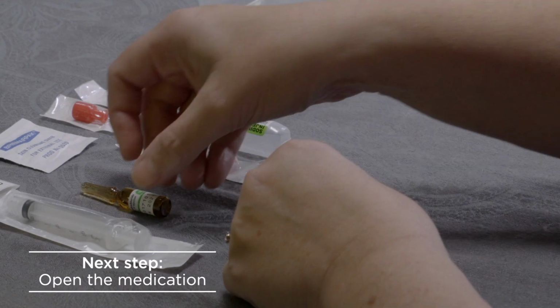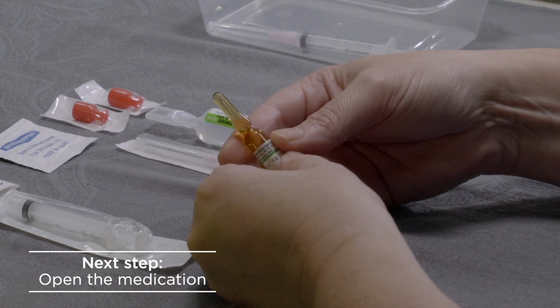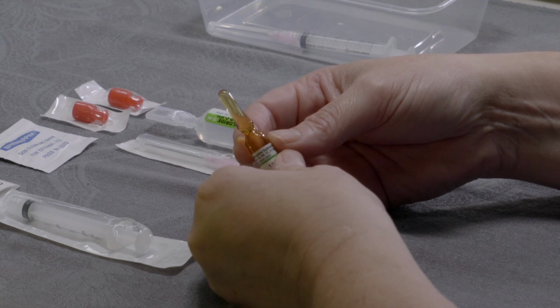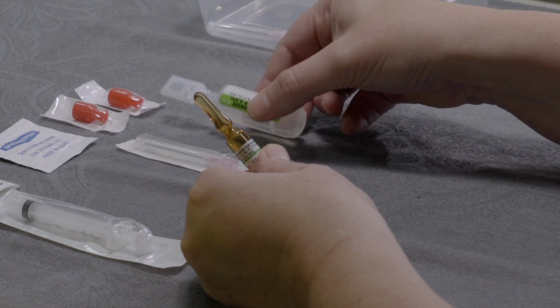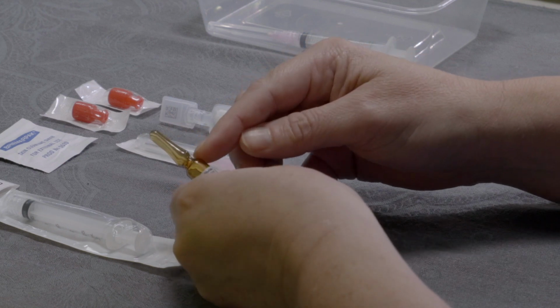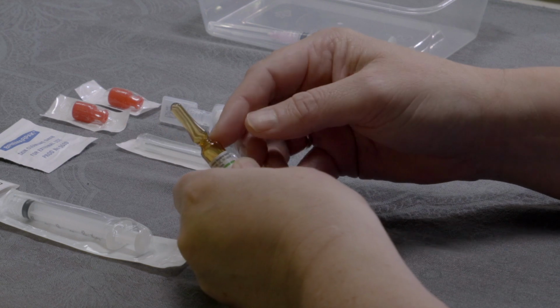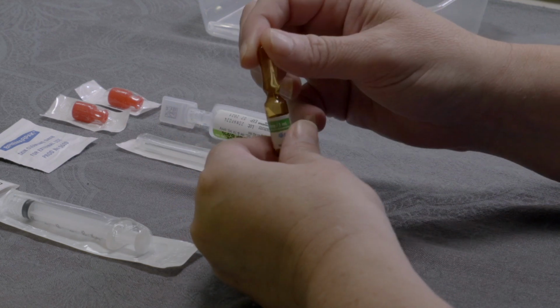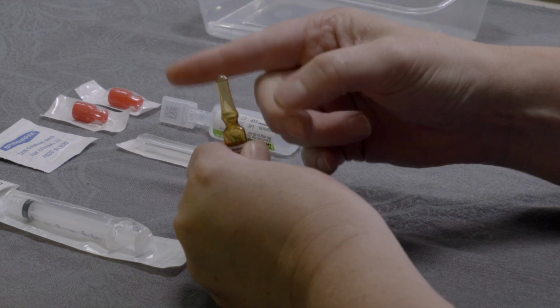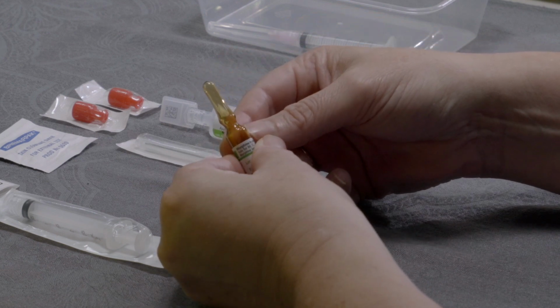The next step is to open the medication. How you open the medication will depend on the medication that you are giving. Most medication will either come in a glass or plastic ampule. If you are using a glass ampule, you will need to snap the skinny end off at the top. Before you do this, have a quick look to see if there is any liquid still in the top. If there is, gently flick the top with your finger until the rest of the liquid sinks to the bottom.